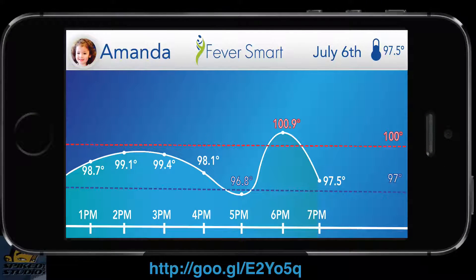After running the device for a while, I'll put up a sample graph. Mine was pretty consistent, and they have graphs on their website showing how it looks over time. I did run it in local data collection mode for a while. However, one issue I had — which may have been specific to my unit — is that every so often it would lose battery contact. Inside there's a very thin metal strip that pushes up on the battery, and unless I had pressure on it, I couldn't get the device to work reliably. When it was functioning, though, it worked fantastically.